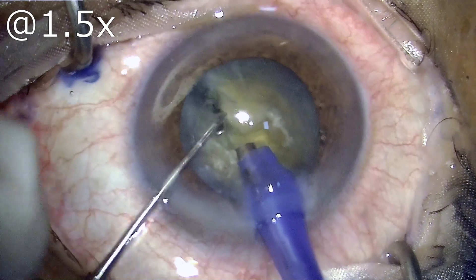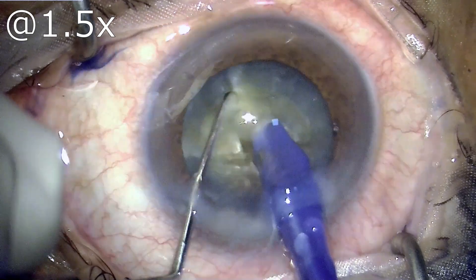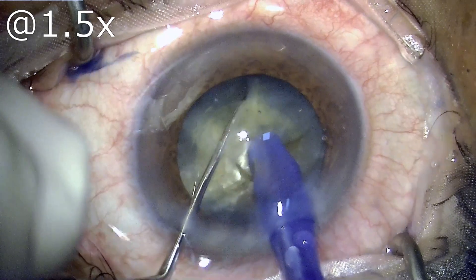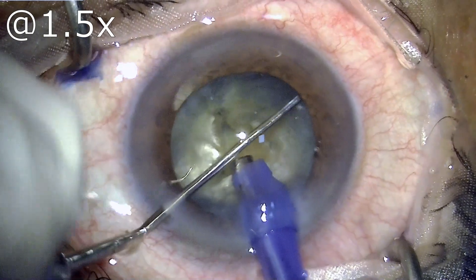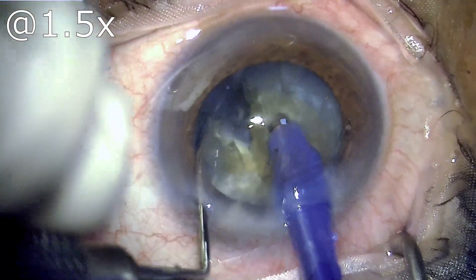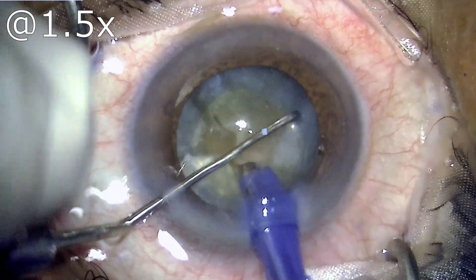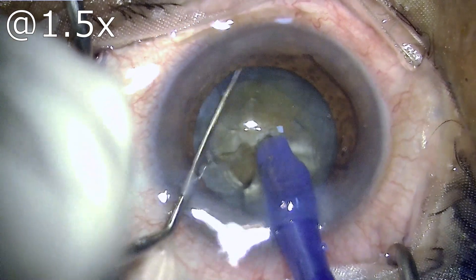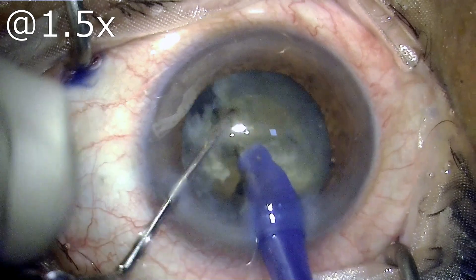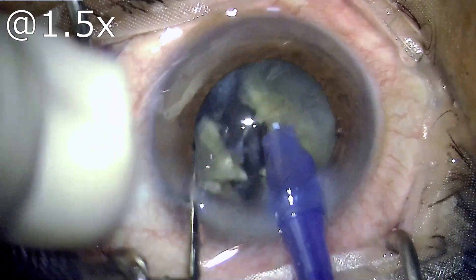The trick I am going to demonstrate is: do not crack this nucleus into four pieces; rather crack them into eight pieces. I am using a direct horizontal chop technique, and horizontal chop techniques are known to reduce the amount of phaco power required. I will also emphasize that it is not essentially the phaco power dissipated inside the eye that causes corneal endothelial damage, but rather the rubbing of nuclear chunks on the endothelium.